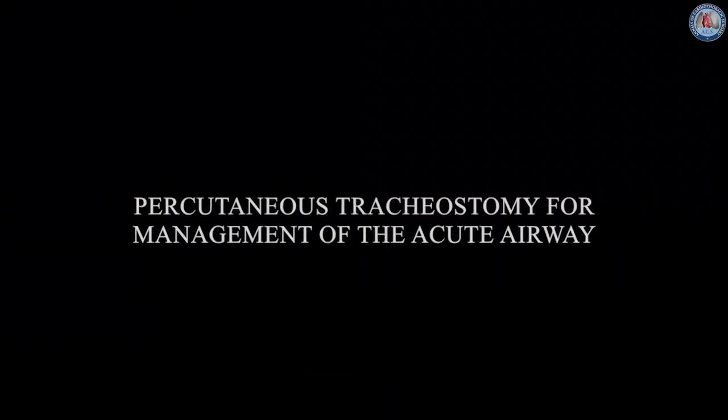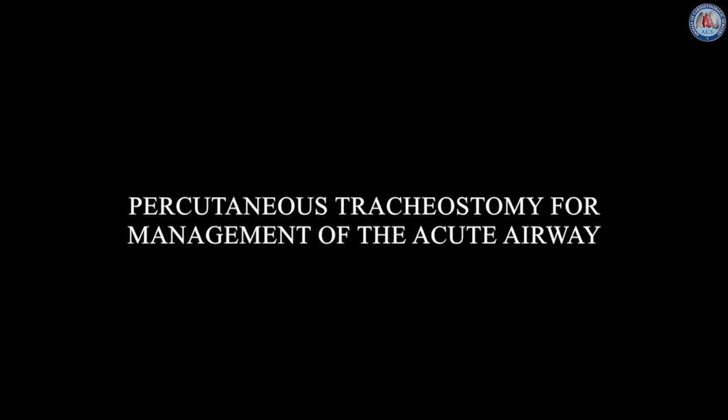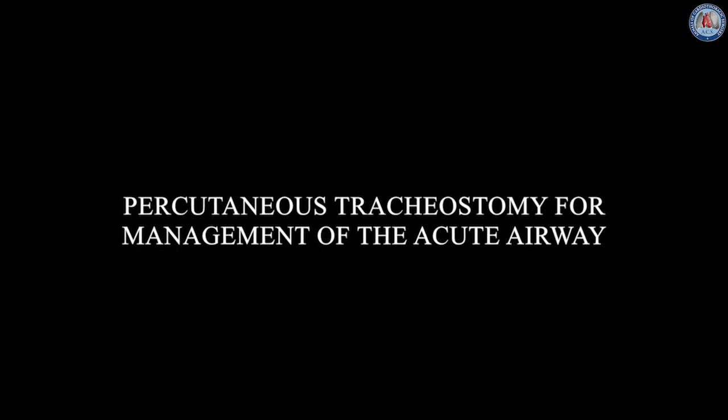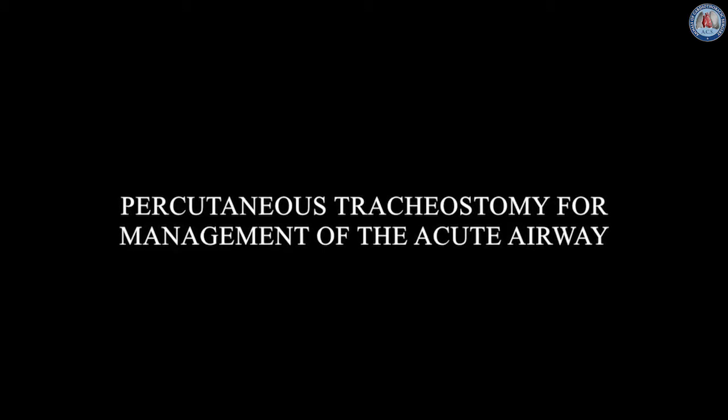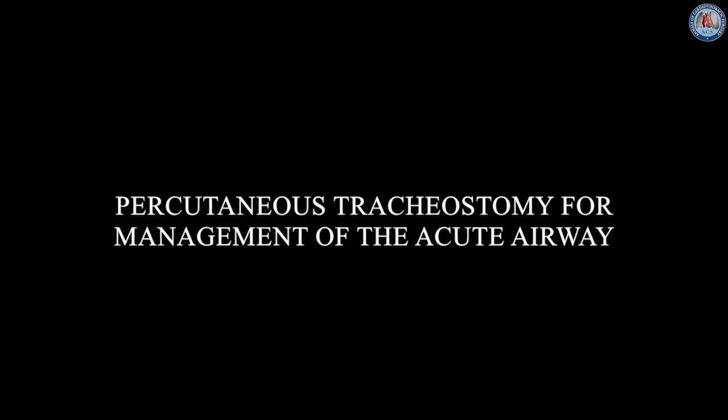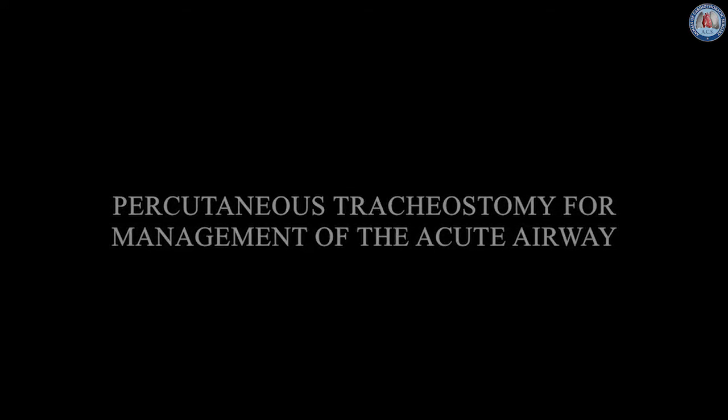In this brief video we will demonstrate the technique of percutaneous dilational tracheostomy in eight steps using a Siaglia Blue Rhino kit. The procedure is performed as if for control of the acutely compromised airway and therefore deviates from the intended approach, as there is no fiber optic bronchoscopy.